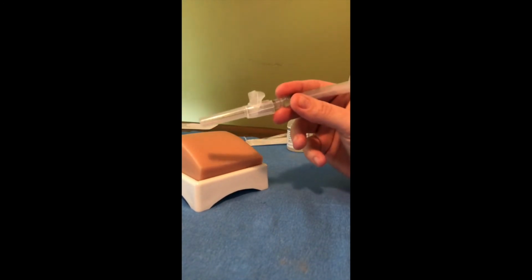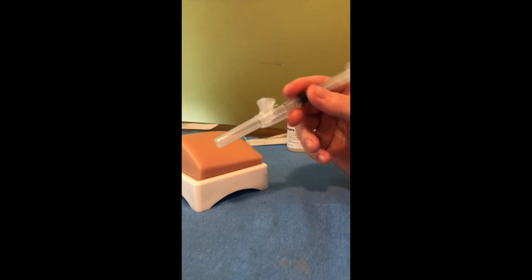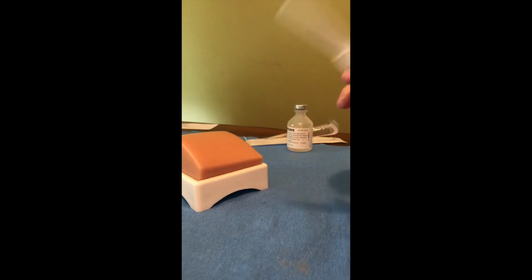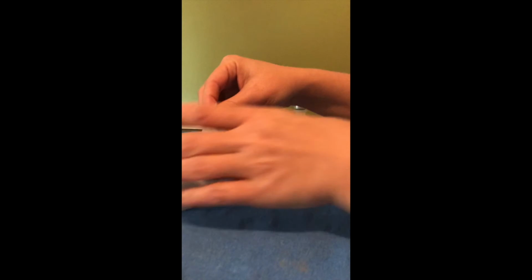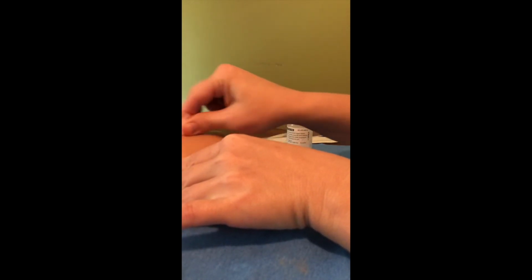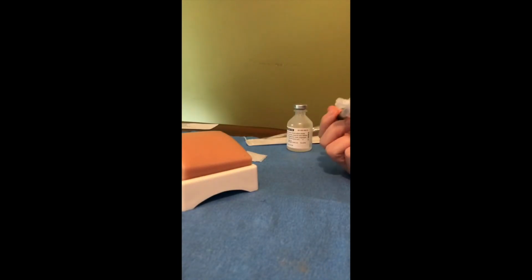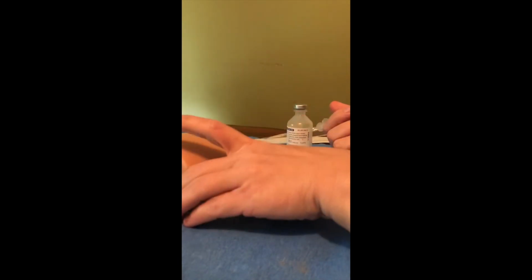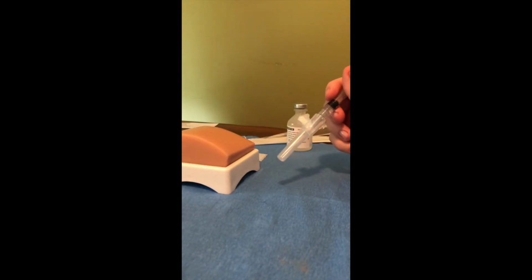Now one of my biggest things when I'm doing injections and teaching injections is we do not switch hands at all under any circumstances. We clean our area. Let that air dry. Now, this injection is going to go 90 degrees. So whether this is a deltoid or the hip injection, you're going to do 90 degrees.